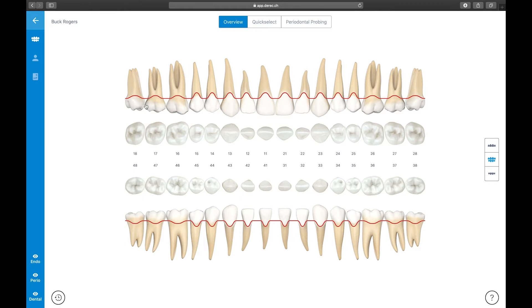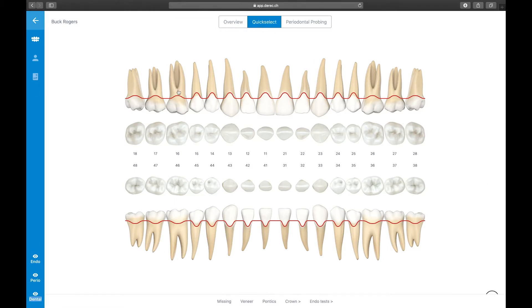One way is to enter findings in a batch, and the other to enter findings on a single tooth. Most dentists start the dental recording process by counting the teeth present in the patient's mouth. Let's use Derek's Quick Select option to mark the teeth that Buck Rogers has lost. Select the Quick Select bar item in the top portion of the screen, then mark all the teeth that are missing, and select Missing from the menu on the bottom of the screen.